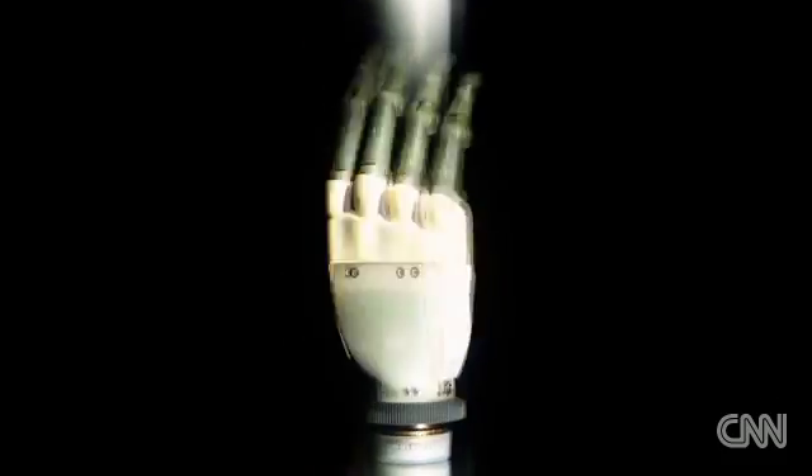This is the I-LIM, a prosthetic hand built with individually powered prosthetic digits.